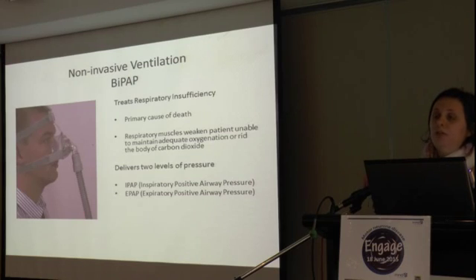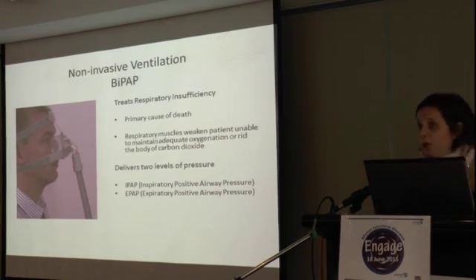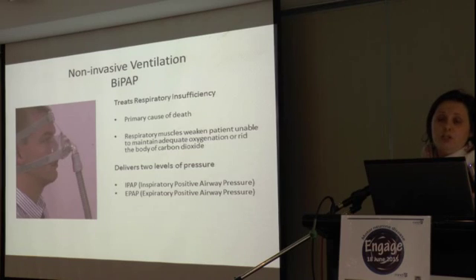It's a similar machine to what you would use if you were having a patient with sleep apnea, except we use a different level, a different machine with a different setup, which makes it a bit easier to manage patients' symptoms. We all do know that patients with motor neuron disease will die from respiratory failure. Sometimes their first symptoms might be a respiratory onset presentation.